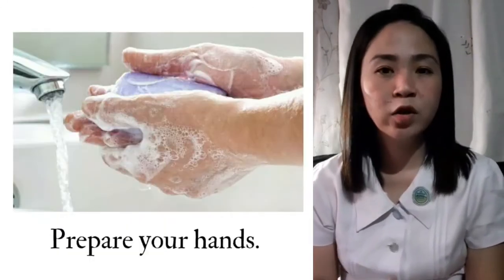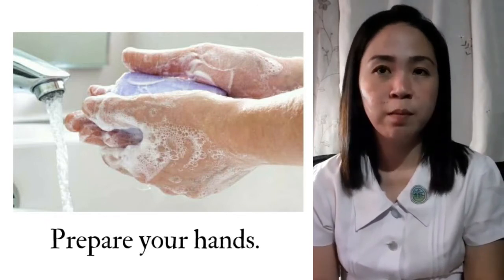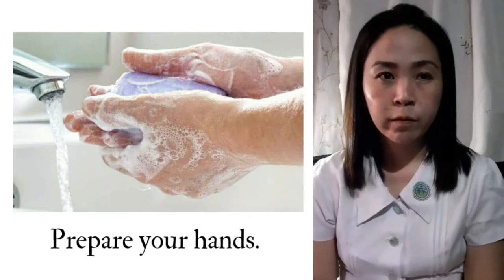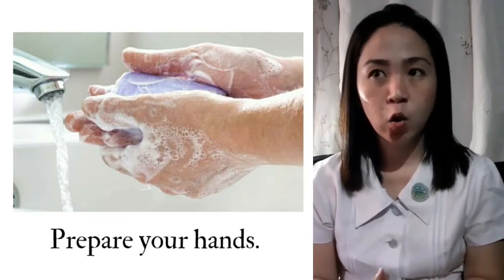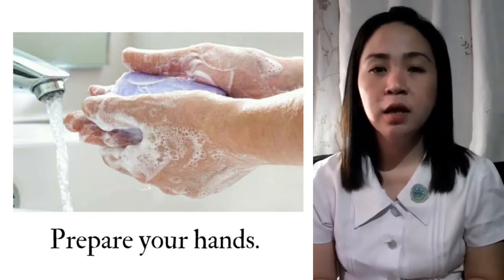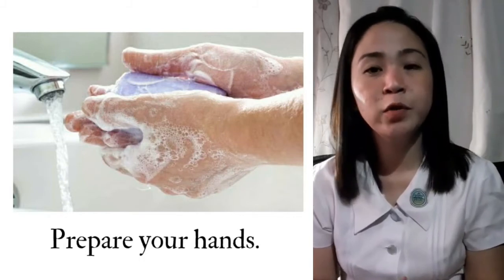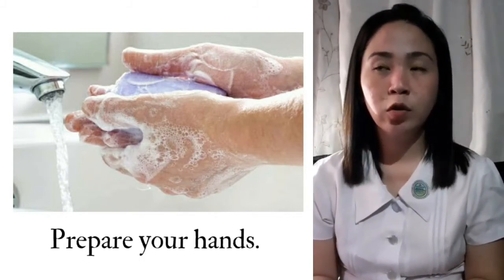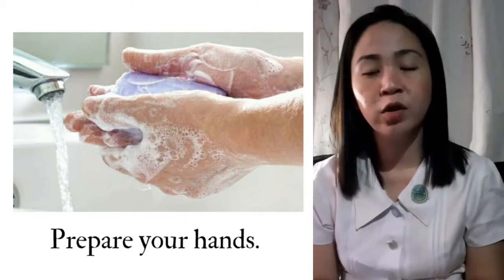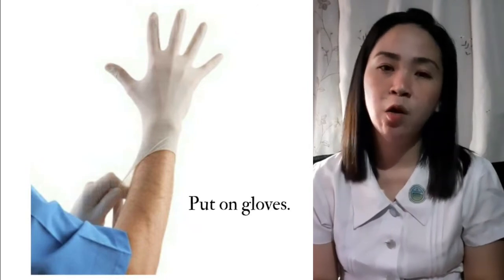Prepare your hands. Proper hygiene is essential to performing venipuncture safely. Be sure to wash your hands with soap and water and dry with a clean, single-use towel. Depending on workplace procedure, you may be able to clean hands with alcohol rub if they are not visibly contaminated. After cleaning your hands, you may now put on gloves.